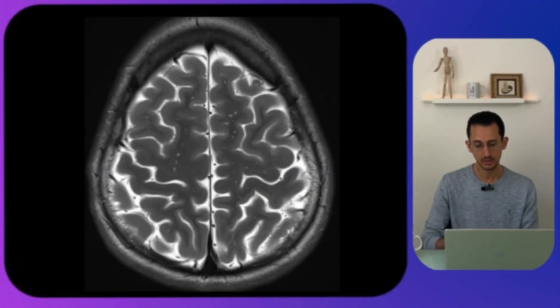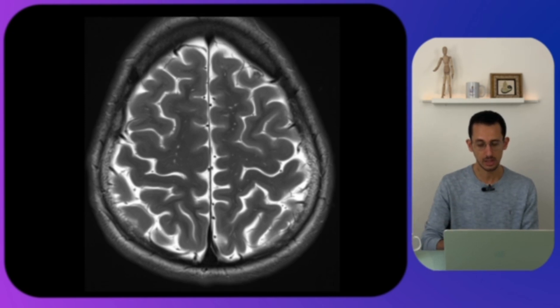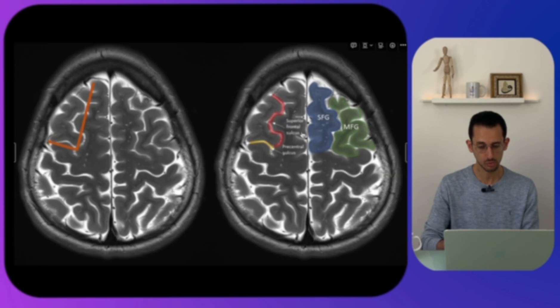Relying on those parameters, we can look at one of the signs. There are multiple ways of identifying the motor cortex on MRI, and the first one we'll talk about is the L sign — or inverted L sign, depending on which side of the brain you look at. This relies mainly on the frontal lobe. Looking at this axial MRI scan, you go to the higher cuts where you can see the frontal lobe and all of those sulci.